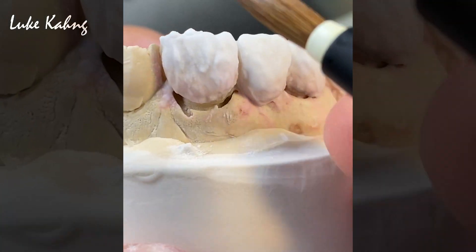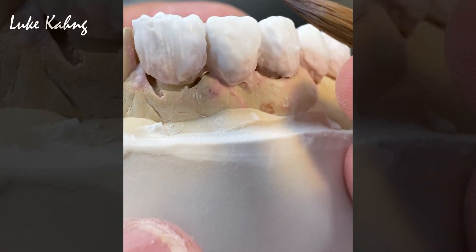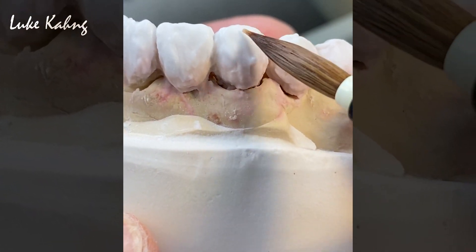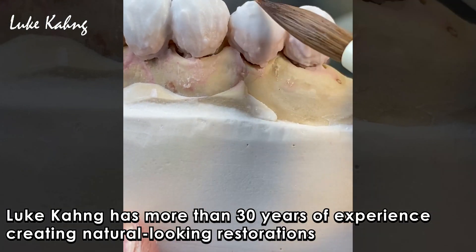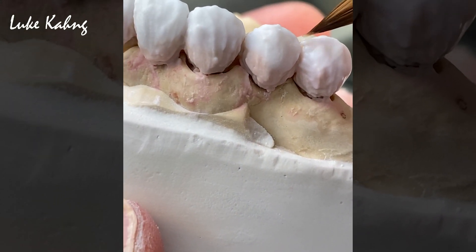Now Luke is using his brush to make vertical lines that would be present in natural teeth. This again causes the teeth to blend more naturally with the patient's natural adjacent teeth. This is also one of the areas where it pays off to have more than 30 years of experience and knowing what natural teeth really look like.